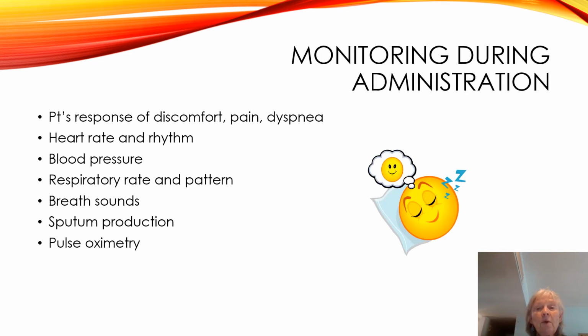So we want to know, how's this patient doing? Do they have any pain, any shortness of breath? There are patients who do breathing treatments and they will tell you, every time I do one of these, I get a little bit more winded. However, after about 20 or 30 minutes, I'm able to breathe much better. So I don't want to stop this treatment. I need to keep it up, okay?